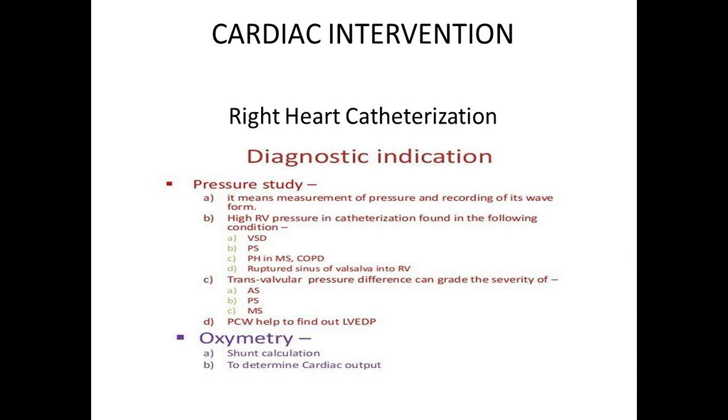If there is an atrial septal defect, you're going to have a mixture of the oxygenated blood from the left side going to the right side. So we talk about the oxygen saturation step up. The oxygen level in the right-sided chamber is going to be elevated. So if you have an ASD, the oxygen saturation in the right atrium is going to be elevated, and also in the RV. If you have a VSD, you get a much higher increase in your oxygen saturation in the right ventricle, and then a PDA, the mixed venous oxygen.